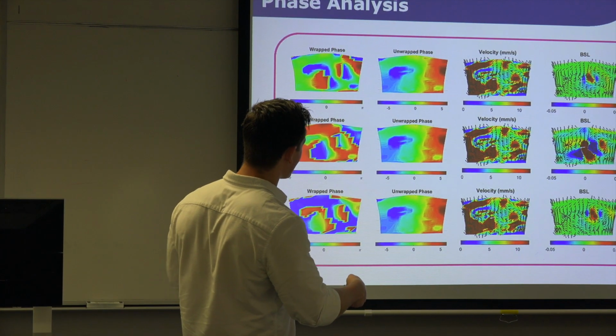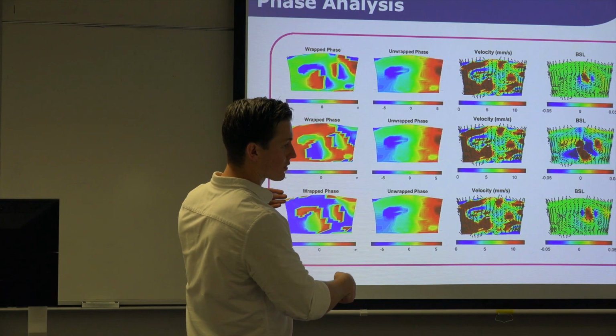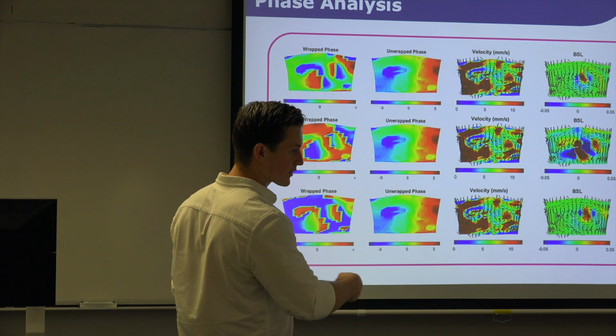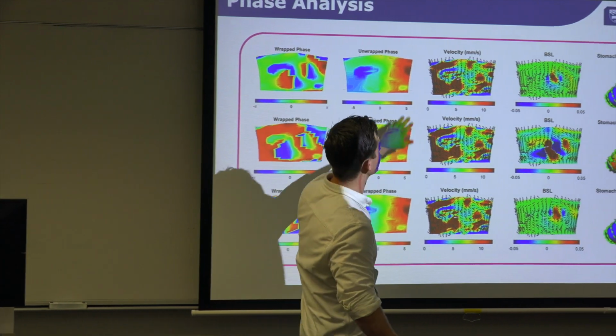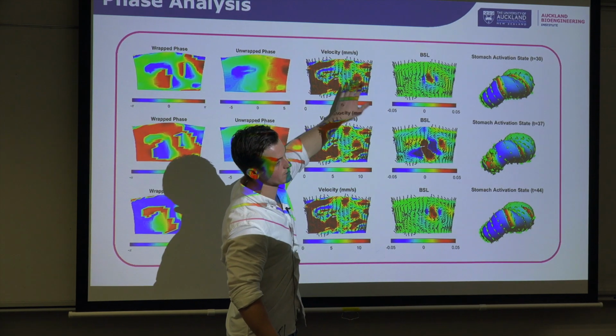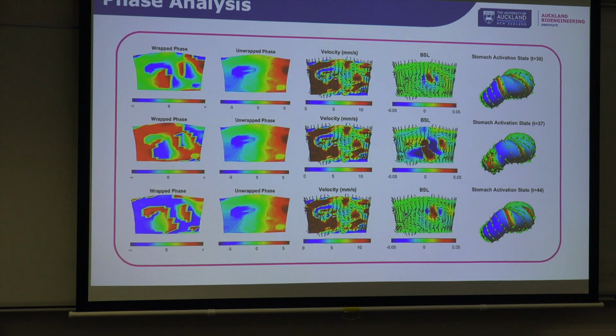We're projecting the serosal activity onto the body surface, which in this case is the board. If you're further away, the velocity will increase relative to the actual motion of the serosal. That's why you see this increase in velocity way over here, because the stomach's here. So it's a non-linear problem, and there shouldn't be a one-to-one relationship between the two.